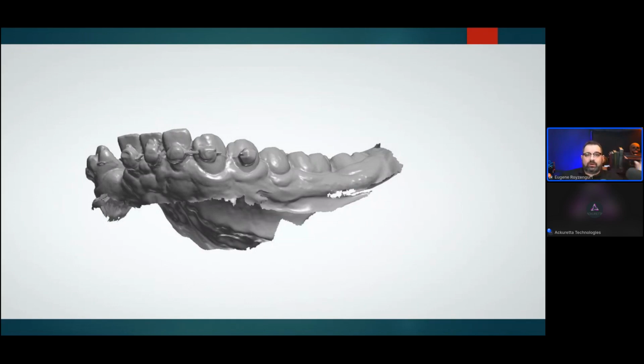So the curing unit, the washing station, everything else. So you need to print on this one, you need to do the washing station for 3 minutes, and then you need to post-process and cure for this profile for that long. So as far as FDA is concerned, you followed everything from start to finish.